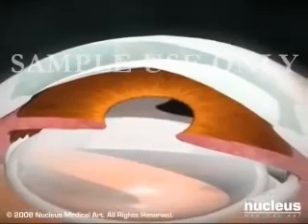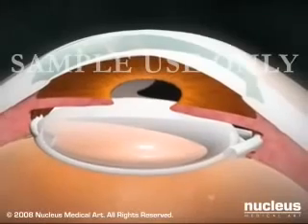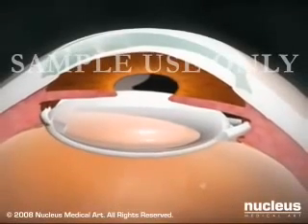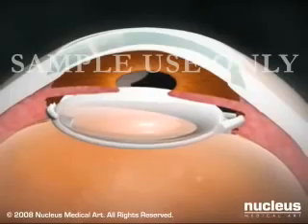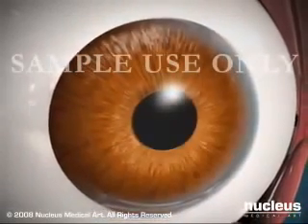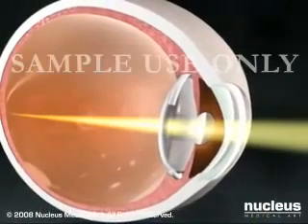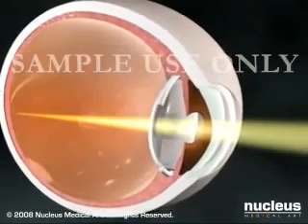Intraocular lenses, made of plastic, silicone, or acrylic compounds, have no moving parts and last for the remainder of a person's life. Because the incisions are so small, stitches are generally not necessary. Vision often improves notably immediately after surgery.